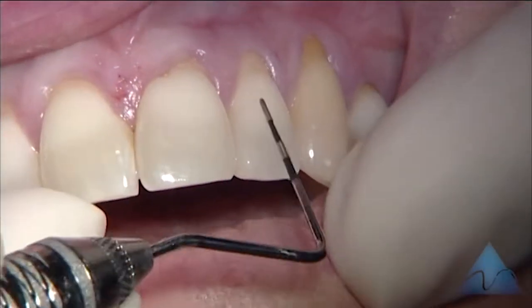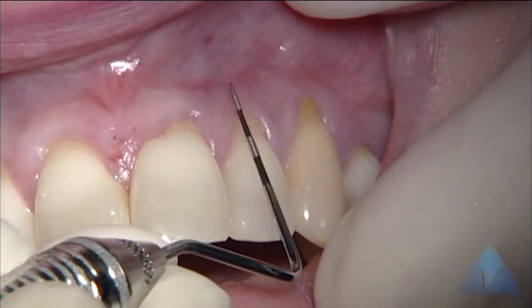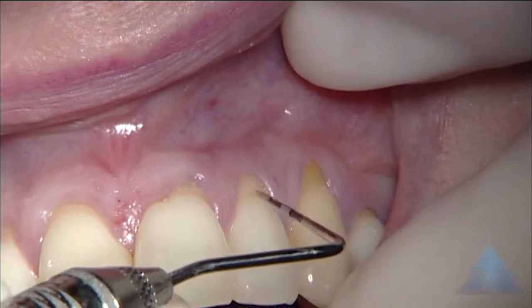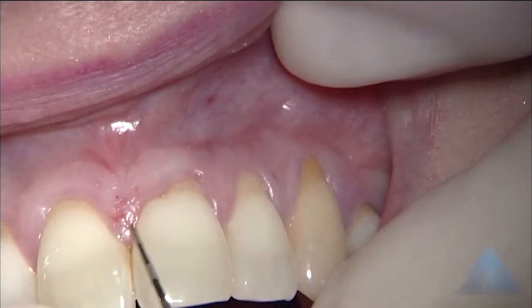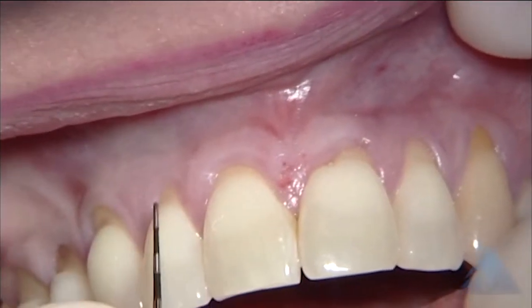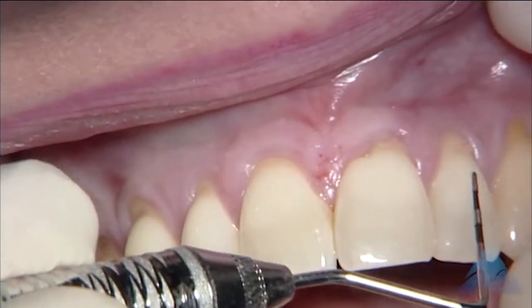As we come forward, there's probably approaching three millimeters of attached gingiva on the lateral, and thickness is okay. The central has three millimeters — good thickness. A good three on the right central, probably three on the lateral as well. So all those are good in terms of zone of gingiva.